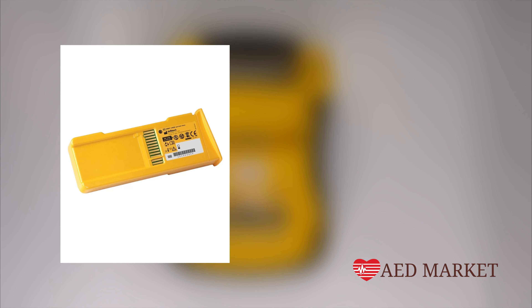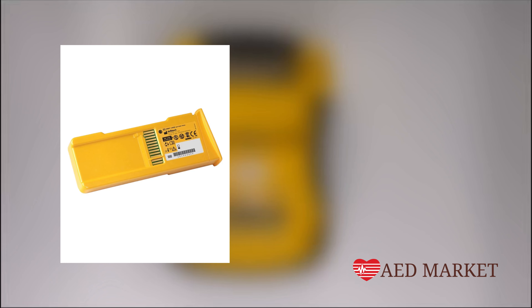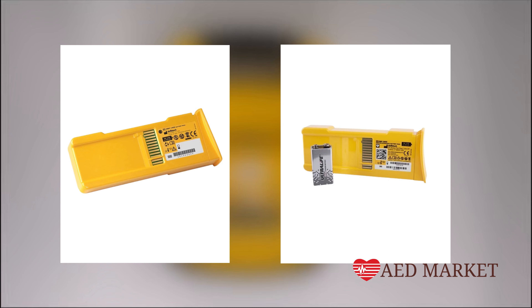The main battery boasts a five-year warranty. The DefibTech AED's battery stands out from other AEDs due to its unique design. It features a primary battery to power the unit and a separate 9-volt battery for conducting self-tests. If the indicator light is not flashing, it's likely time to replace the 9-volt battery.